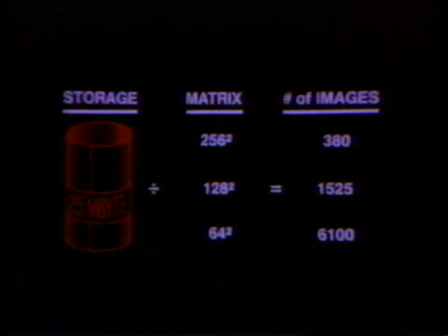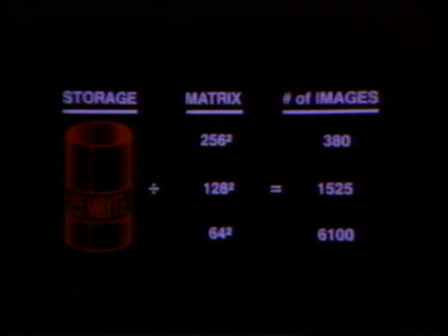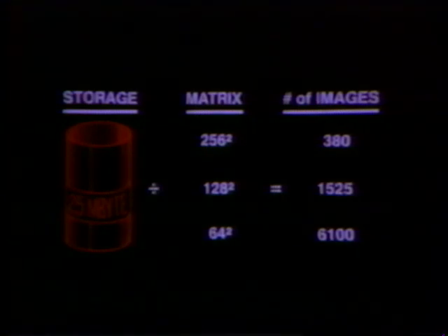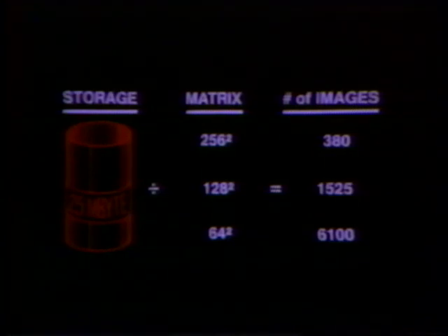Therefore, to conserve disk space, the technologist or physician will decide which matrix size to use for acquisition based on the type of study being performed and the resolution requirements. Well, that was a long way around the answer to the question, how many images can I store on a disk? The answer is, it depends on the type of study you're doing and the matrix size you use for acquisition.